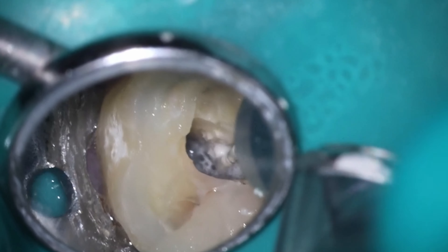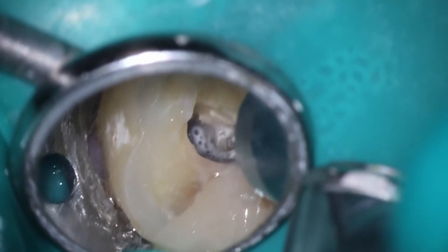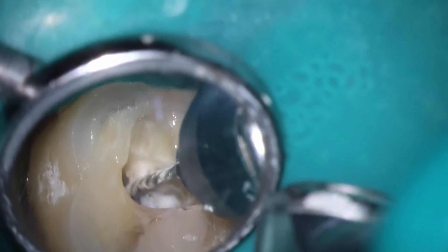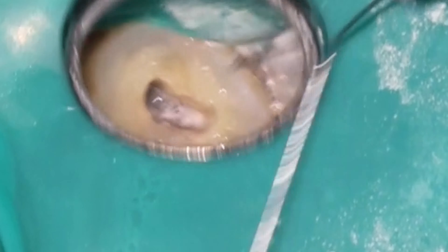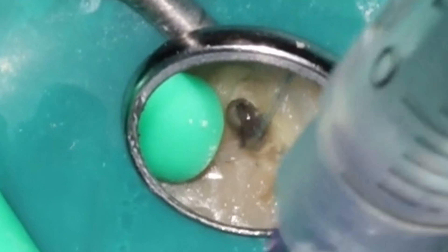The patient left feeling great because the whole case — this is another one where I haven't made any cuts — the whole case is like 17 to 18 minutes. They were very happy to get their tooth feeling better in an efficient manner. I kept everything nice and small so that the tooth is strong. In this case I didn't restore because this dentist prefers me not to, but it's a good example of thinking about things in a different way.